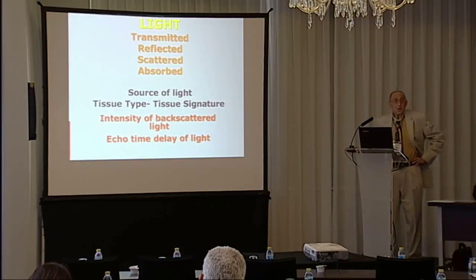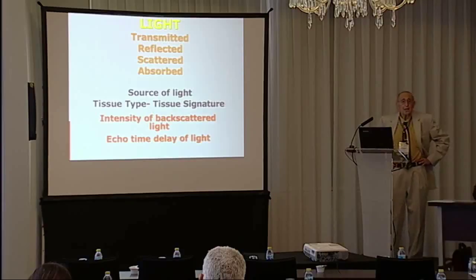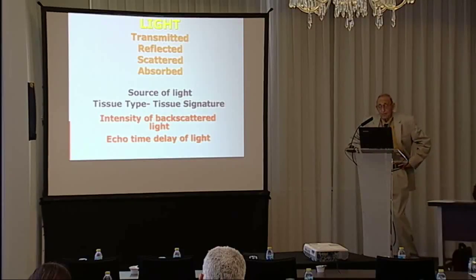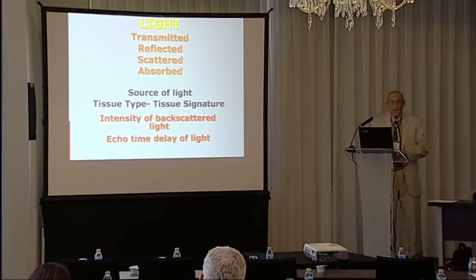Light, we have transmitted light, excuse me, reflected light, scattered light, absorbed light. Your source of light, you have a tissue type, tissue signature, you have an intensity of backscatter light, and echo time delay of light.